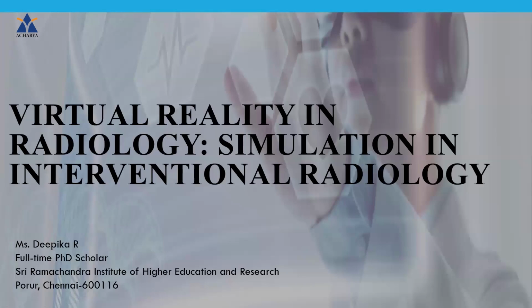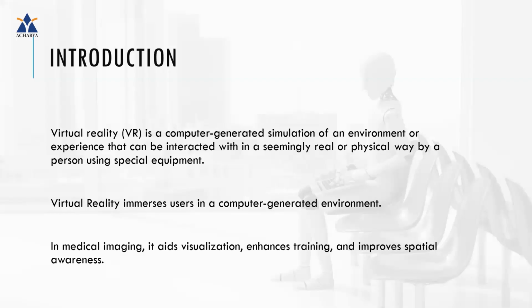So basically, virtual reality is a computer-generated simulation of an environment or experience that can be interacted with in a seemingly real or physical way by using specialized equipment. So you'll have a computer-generated environment that can be created using multiple hardware and software.